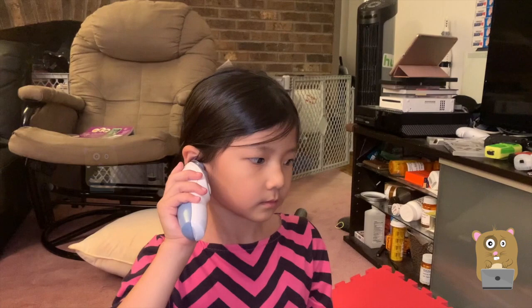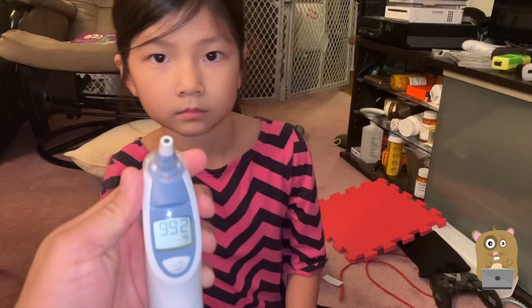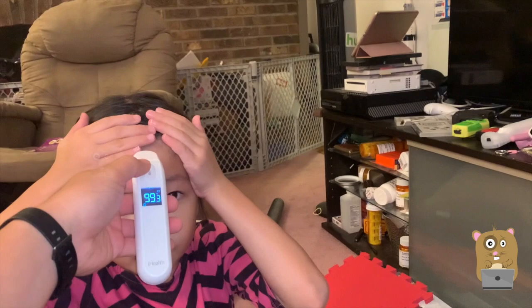So that took about how many seconds? 99.2. That took about 3 seconds or so. Whereas something like this, move your hair up again, oops. 99.3. This took about a second.